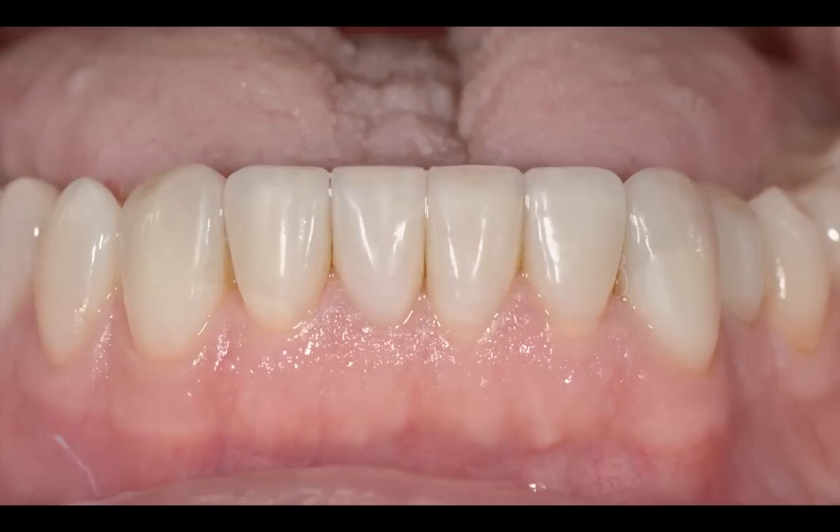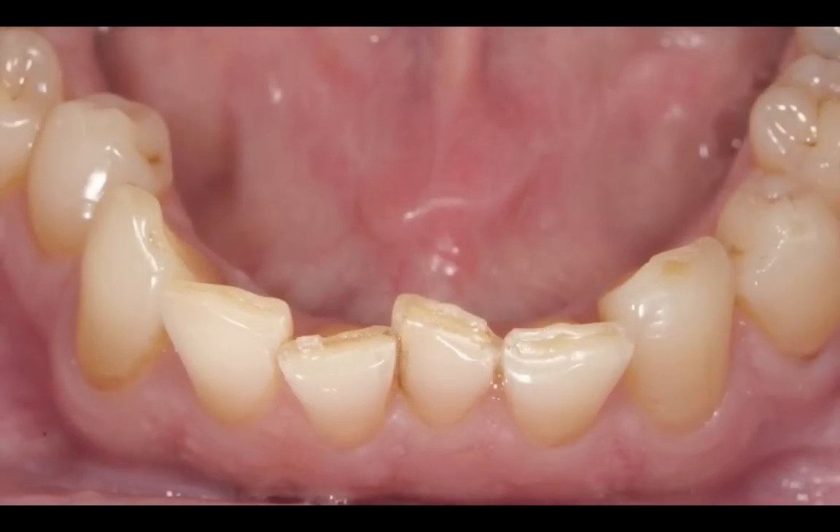The restorations are very lifelike and aesthetic — they're not like monochromatic white restorations. They look like teeth. And here are some other views. This is before — actually quite a good ortho case. If he had opted for ortho or Invisalign, we could have set up the case a little easier.